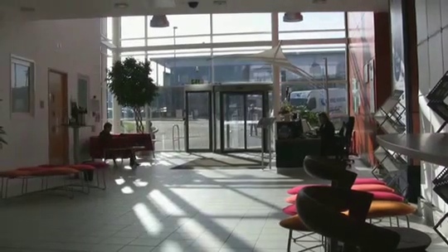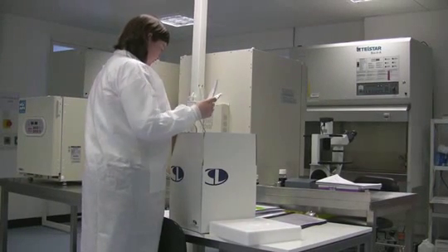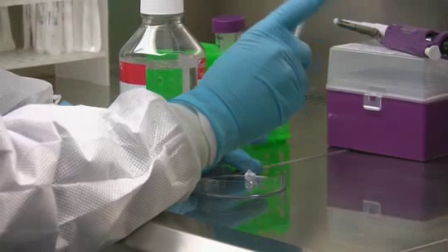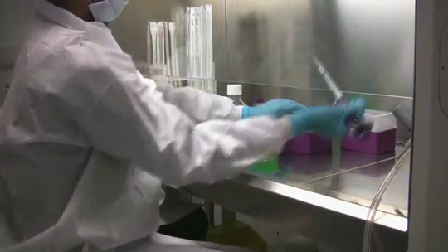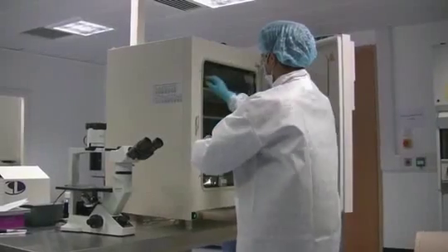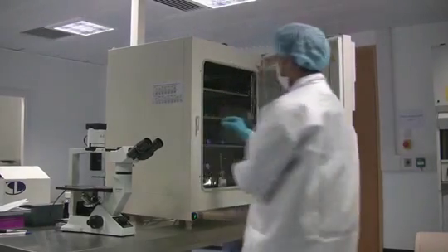Once our laboratory receives the kit and your child's paperwork is completed, our laboratory aspirates the milk away from around the tooth. We rinse it and complete a decontamination procedure. The cells are extracted from the tooth's dental pulp and are placed in a quarantine incubator. They are examined daily for contamination and to ensure good cell growth.